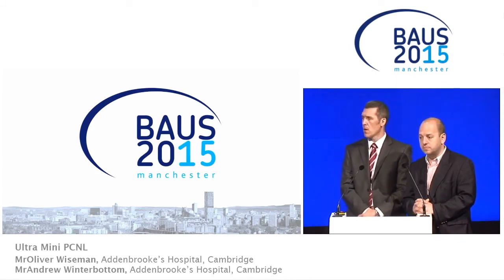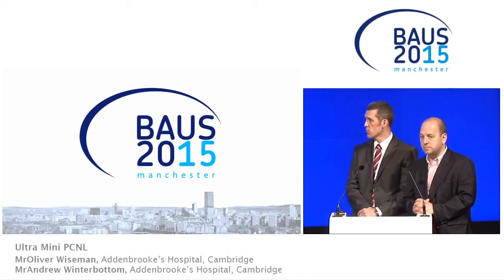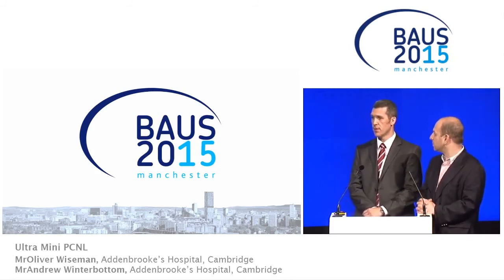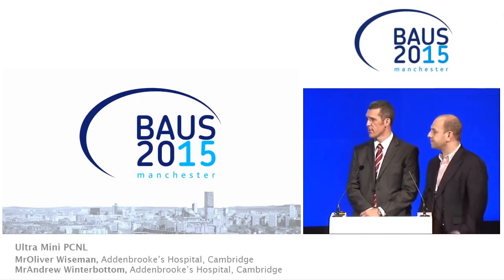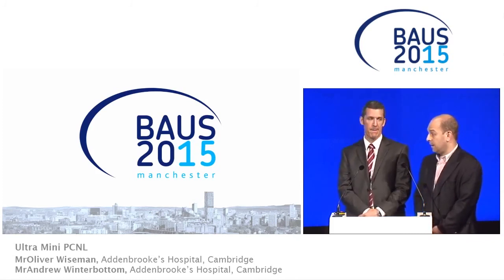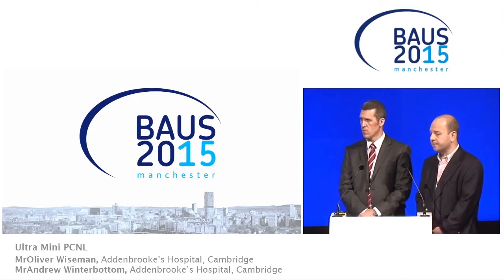No. You'd be surprised how quickly a nephrostomy track seals once it's fallen out. The number of patients we get where the tube's been out for 16 hours, we can't get back down them. So these holes close up. And certainly your scar looked impressively small at the end of that video. Yeah. So you saw the incision there and the stone fragments that we got out. Patient was stone-free afterwards, as I say, home the next day.